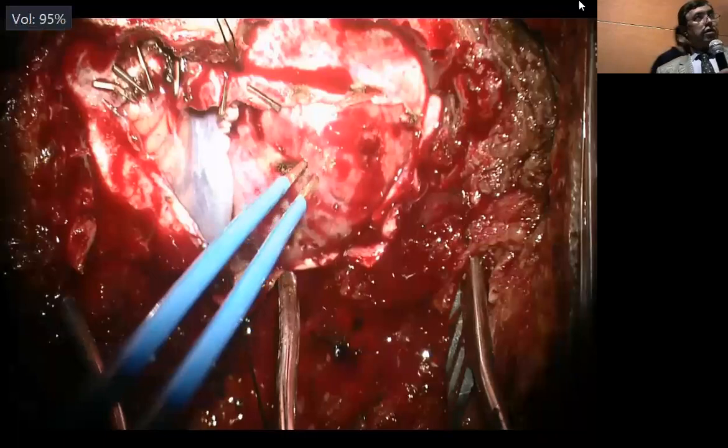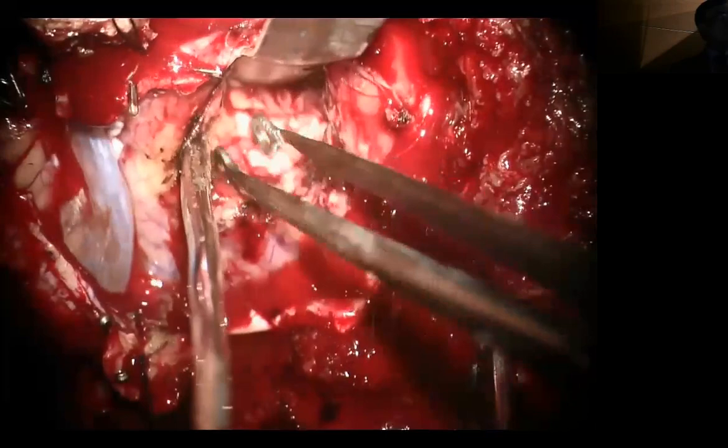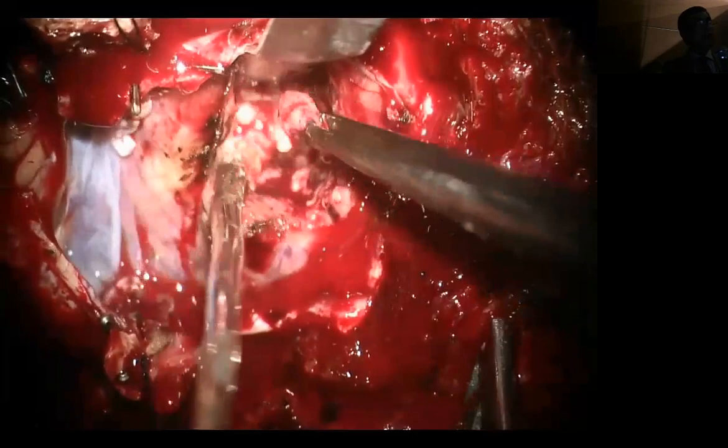So as I said, the patient is sitting. This is midline, this is left side, this is right side, this is foramen magnum. I'm doing the transverse section, I'm going into the tissues. Here I am. You could tell this is abnormal because it is tumor, it is just elastic, and this is not the normal brain. So we take as much as we can of that lesion.